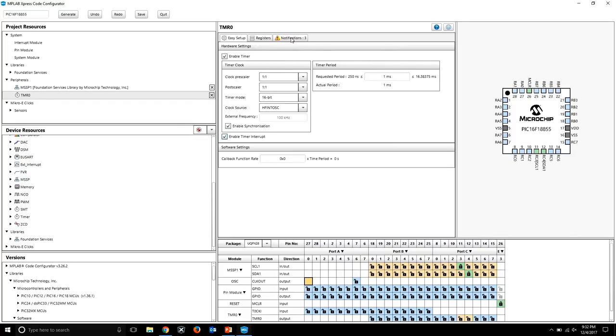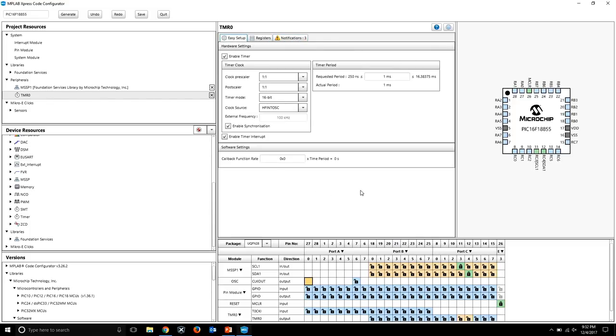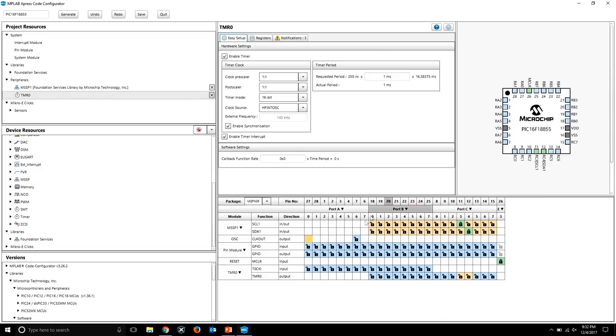But it's a good point, Edwin, that MCC does notify a few things here and there. Under the notification window, you do have some stuff that will tell you. It's a good spot to keep an eye on, because if something shows up as red and tells you that you completely messed up on a particular peripheral or pin configuration, you can go to the notification and see what's going on. It could be something simple, like you selected a peripheral but never activated it, and you're scratching your head figuring out why the lab is throwing your tools at the wall. Yep, that's correct. All right, so we have done this far.